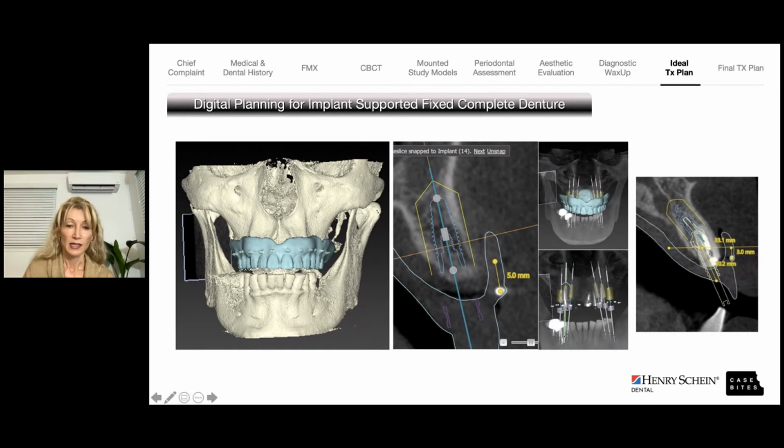As I said earlier, I don't know at this point where my implants will go. We didn't have the CT scan yet. However, now I have all the information. We can evaluate the different sites. We can see how we want to spread out those implants, what angulation they will go, and then determine how they would position in relationship to the teeth, but also how they would position in relationship to that retracted lip position.